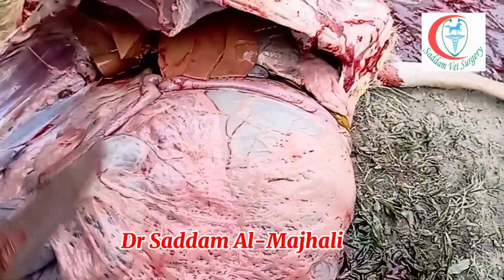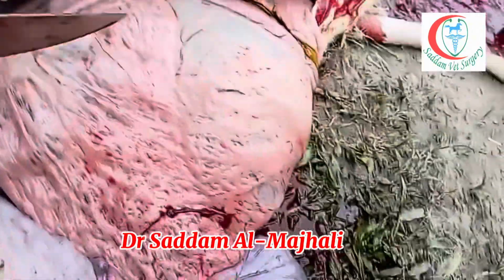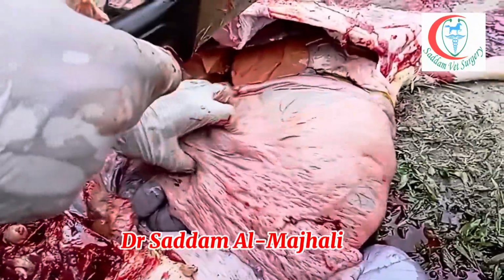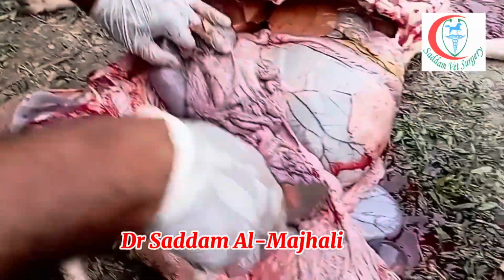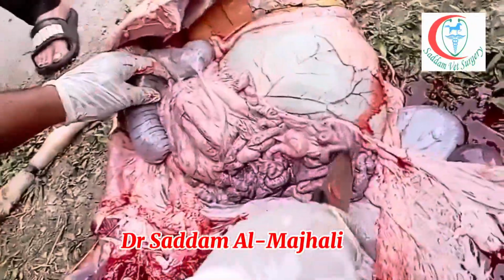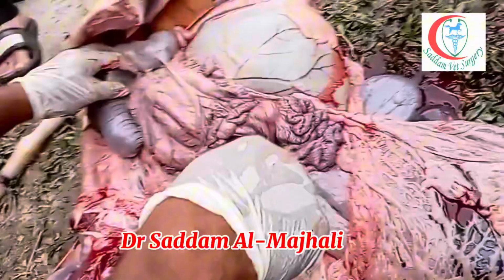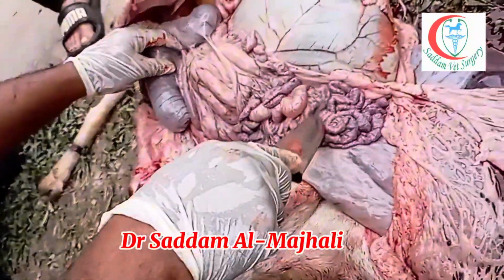A lot of bacteria in the body give toxin. Toxin goes to the liver. The liver catches the toxin. Okay, in the abdomen I can also see the general. Small intestine, see, a lot of congestion. This one is because of infection, bacterial infection.